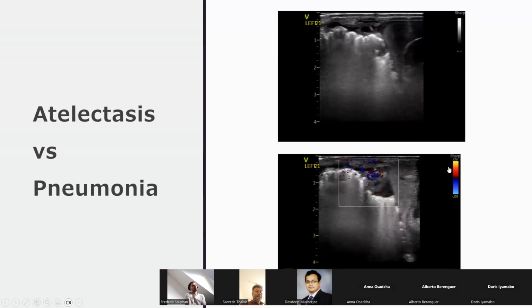Now, the reason I'm showing you this is there's a real risk that if you continue increasing the PEEP, you will make this baby worse. And the reason for that is, a PEEP can reduce venous return, it can impact cardiac output. What is really important when you're doing a recruitment maneuver is that it is the interaction with the heart-lung unit. It is not lung alone. I think if you're not thinking of the heart in this process, then really you are asking for trouble.